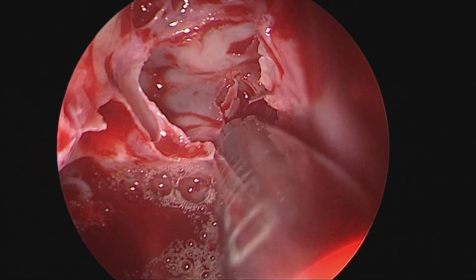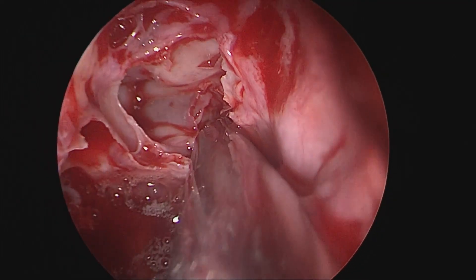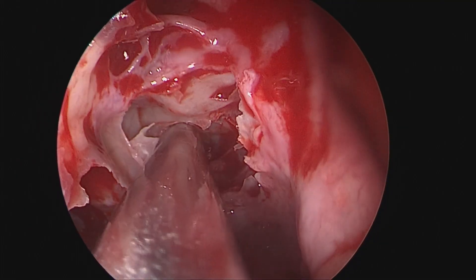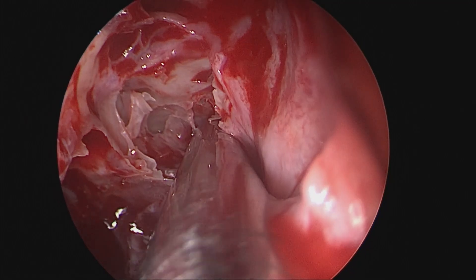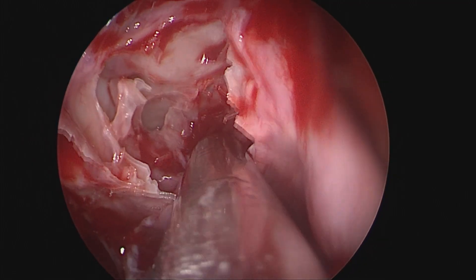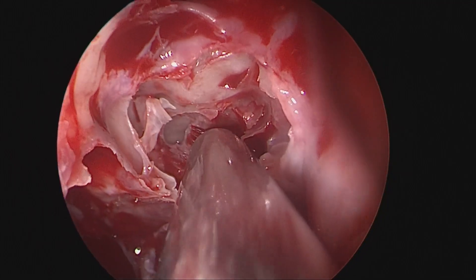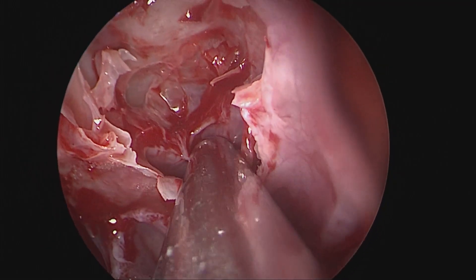The very important way of differentiating these cells is on the sagittal sections. One can clearly demarcate what kind of cells these are, along with the axial cuts as well. Now we are just taking over some of the ethmoidal septations from the posterior and anterior ethmoid while working our way from posterior to anterior.